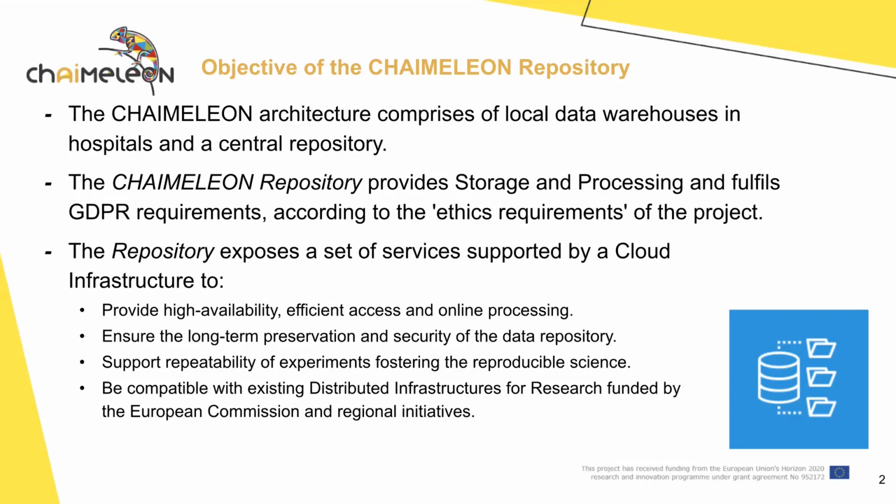This repository exposes a set of services supported by cloud infrastructure to provide high availability, efficient access and online processing, ensuring the long-term preservation and security of the data, supporting repeatability of experiments, fostering reproducible science, and is compatible with existing distributed infrastructure for research funded by other areas of the European Commission.